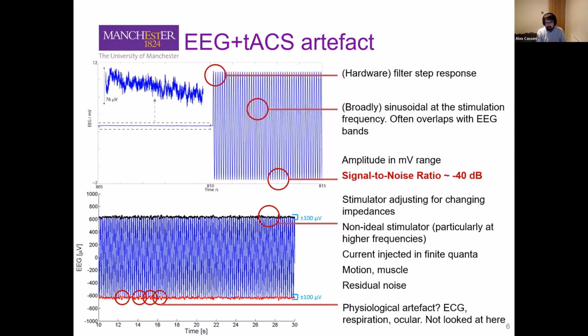We estimate the signal to noise ratio at about -40 dB. There are different ways in which you can quantify that. In terms of the signal processing literature, that's pretty low. GPS, a very different application, goes down to about -105 dB, and you can recover the signal. PPG, so smartwatch motion artifact removal, which has been a big success story in recent years, has artifacts of about -20 dB. So a lot easier than what we're dealing with here.